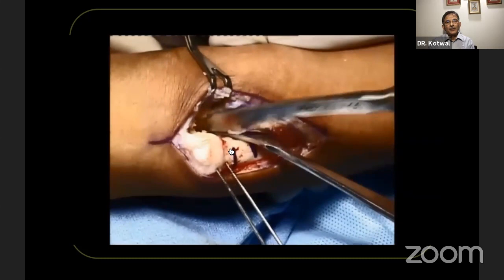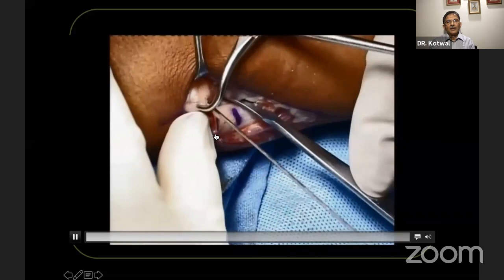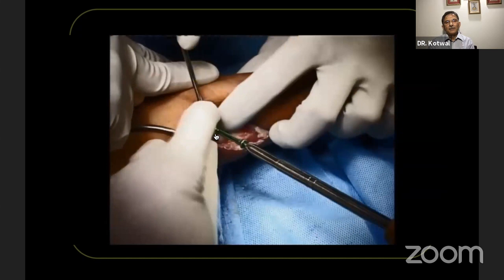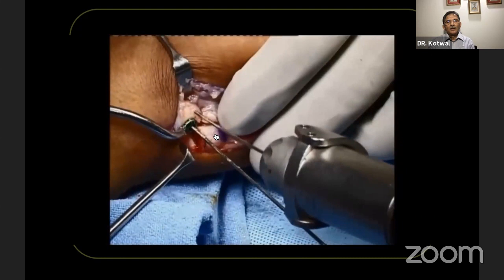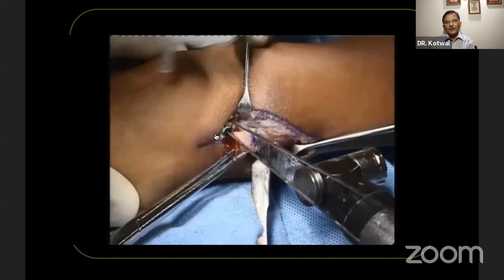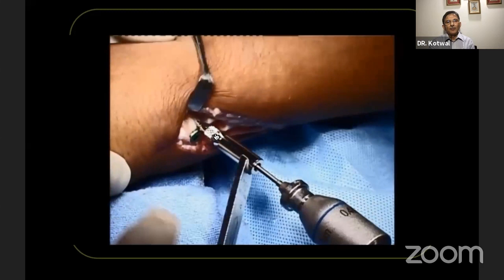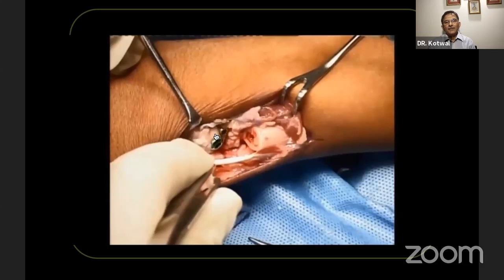After having stabilized the distal fragment, you make a cut, bring those fragments close to each other. Better to put 2 screws, and you can change the diameter of the screws if there is not that much room. Complete the osteotomy, take away that piece of bone. This can be used as some graft to put in.